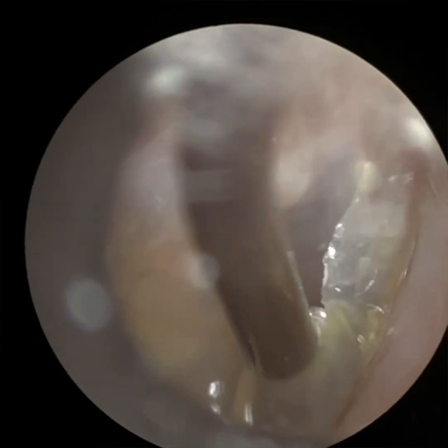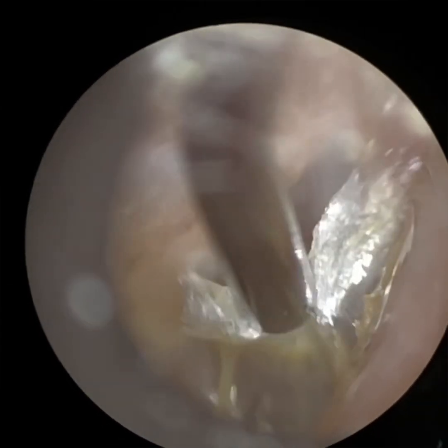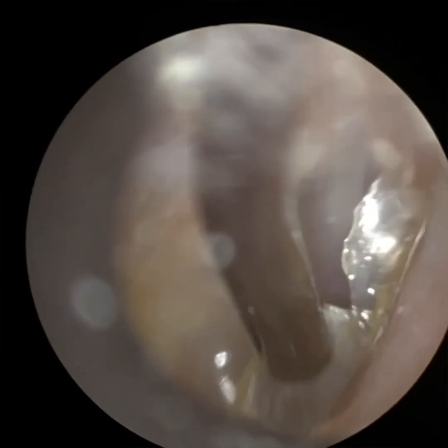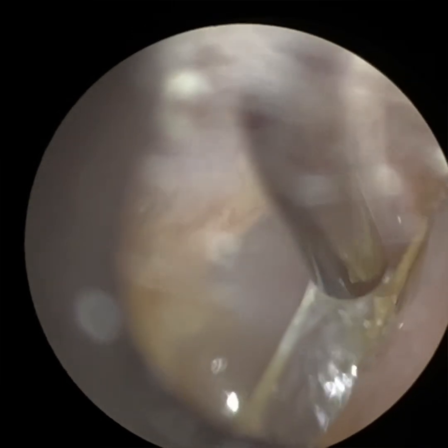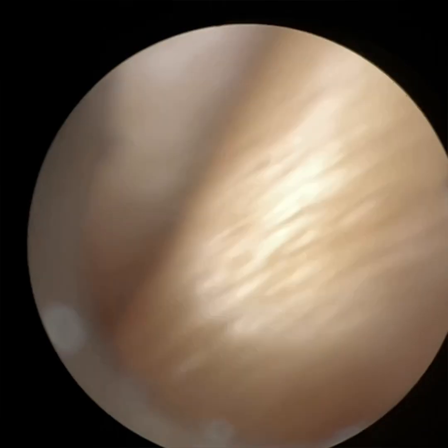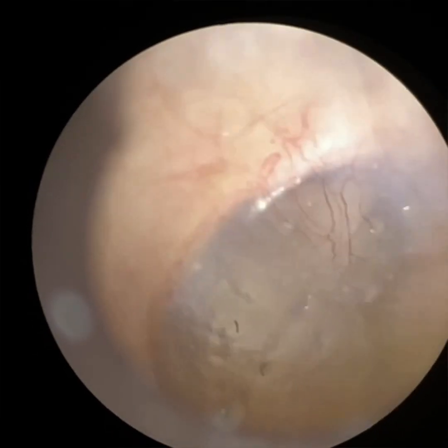Now, I've decided to use the WAXscope, and the reason for that is these are the really tricky conditions where the WAXscope needs to be put to the test, really, when you're removing and peeling skin directly off the eardrum. So it's a completely different view to the endoscope, and the reason for the development of the WAXscope is a lot of people can find using an endoscope difficult.